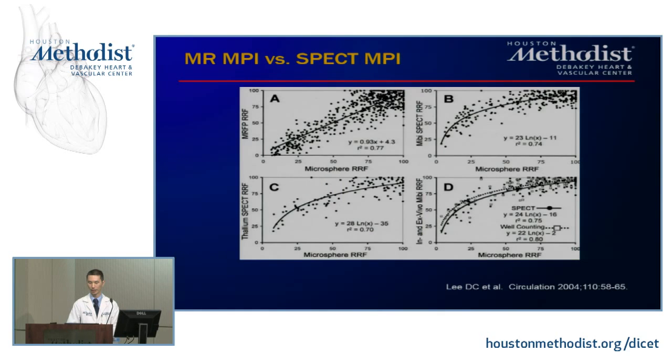Okay. This is just showing more studies from Northwestern, where they compared it to microsphere perfusion as well, and compared it to thallium as well. And as you can see, there's pretty good agreement between the different comparisons here.